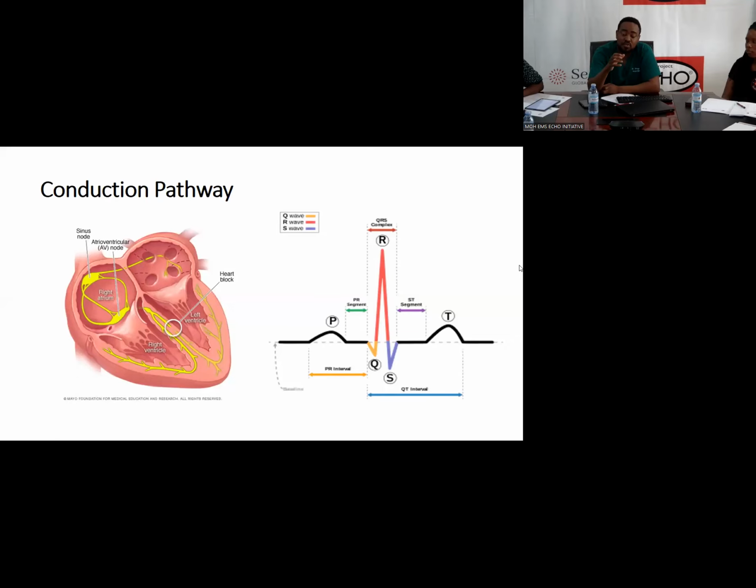Each time the heart beats, those particular events are happening from the P wave to the T wave, and the net flow of charge or electrical impulse is as structured here in the yellow lines that are represented within the heart.